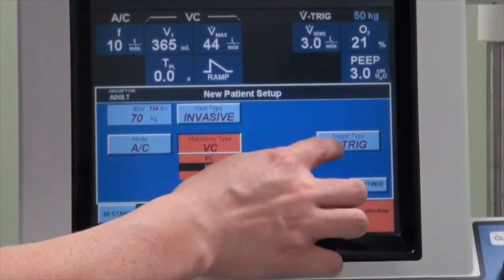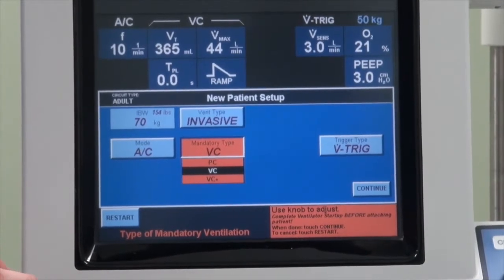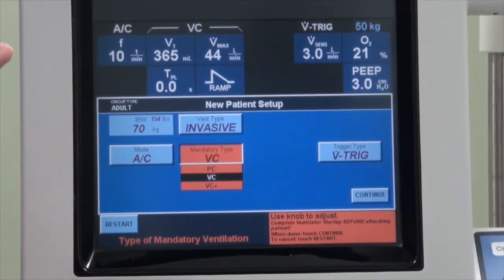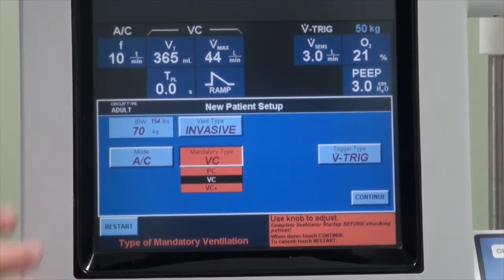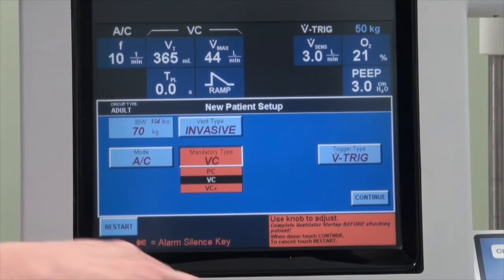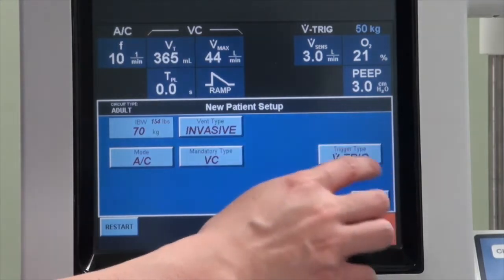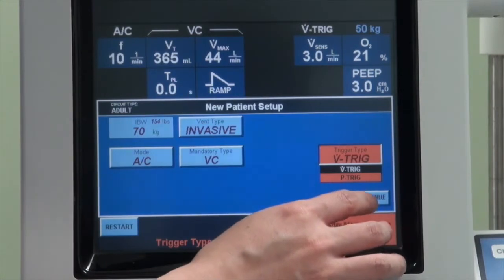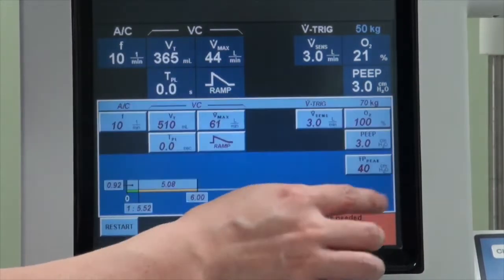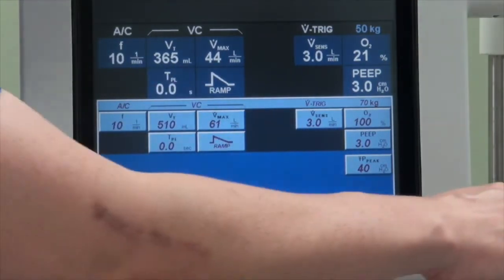The next setting is the trigger, which is how the ventilator will be able to detect that the patient is trying to take a breath. This can be either through changes in flow or changes in pressure. For this particular setting, we will choose a flow trigger. Once you have selected, just press confirm, and if you want to finalize your option, you just need to press accept.